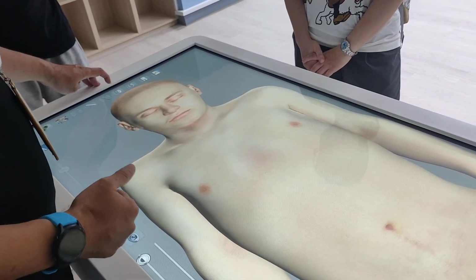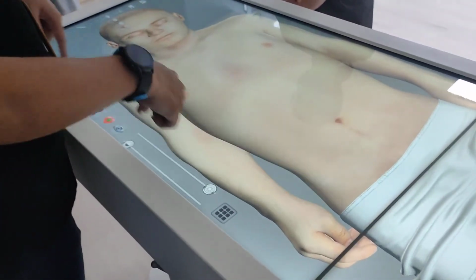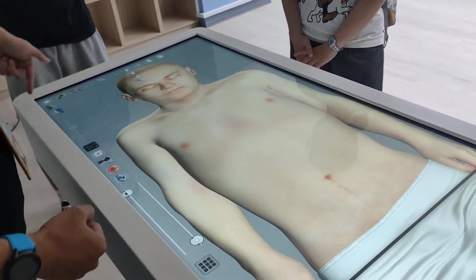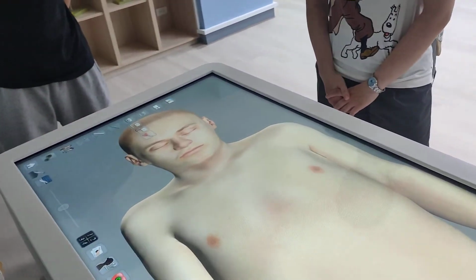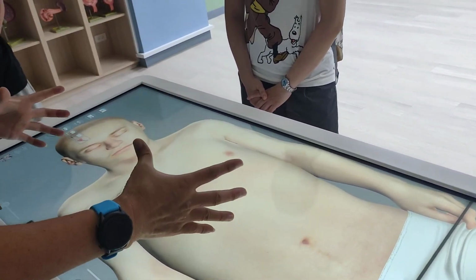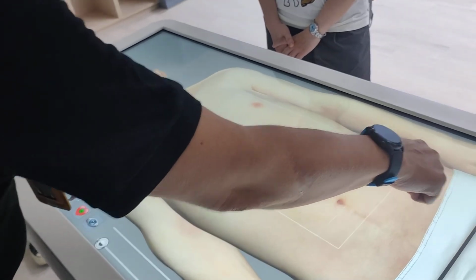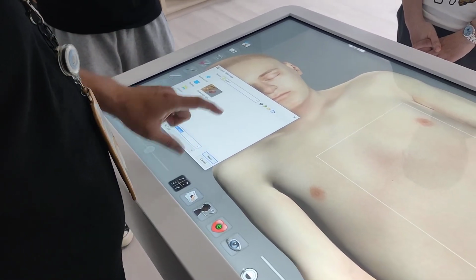And camera is very important for you guys. For example, if you want to take the image of this cadaver, you can do. If you use the first one, your image will contain all of the tool. All right. If you use the second one, then the tool will be eliminated. You can only get the image of the cadaver or the certain organs. And the third one is you can get the specific area. For example, I want to get the area of here. Okay, okay, this is the third one.